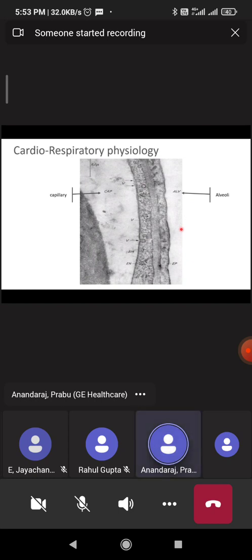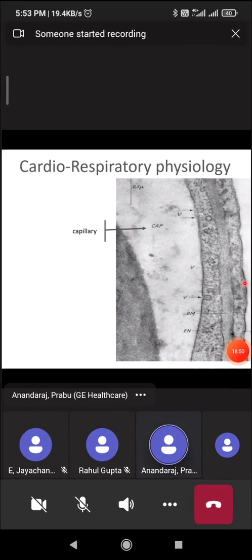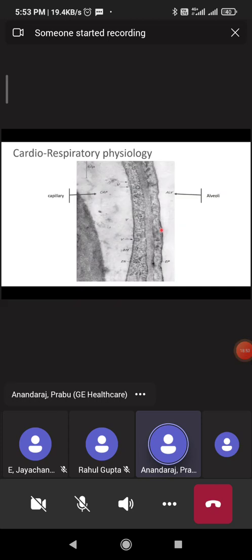So these are the complications we should not be introducing. As an application specialist, you should be knowing the outcome of what we are doing on a ventilator. These are certain things which are not the reason for which the patient is coming to the hospital, but they may end up in this situation if the patient is not handled properly with a ventilator. So bear in mind that oxygen is a toxic gas, and we have to be careful with that. How much we use and how long we use has to be the bare minimum possible.